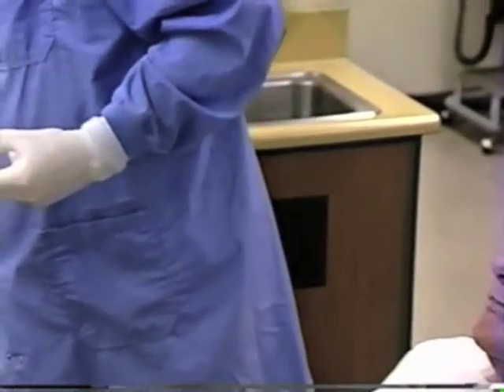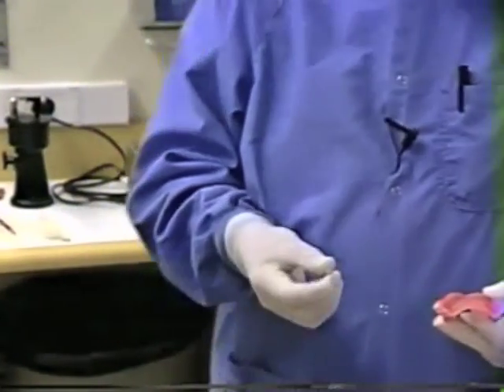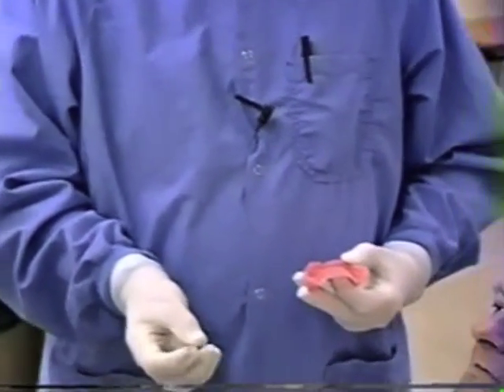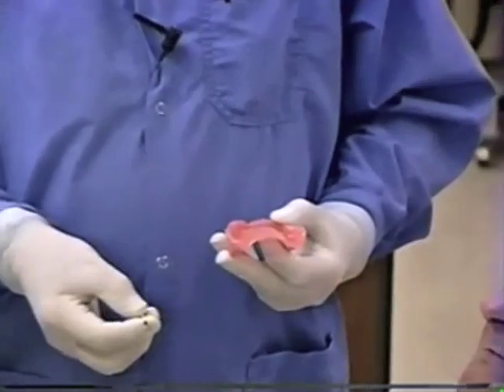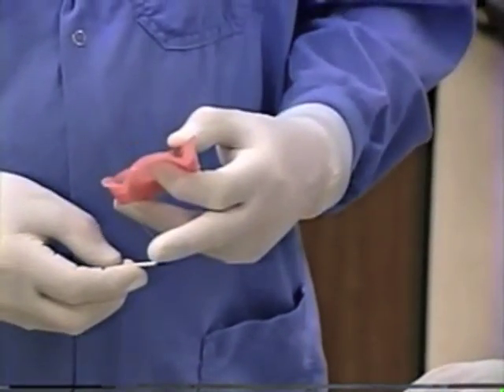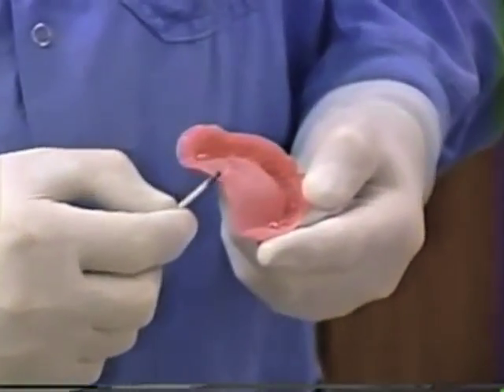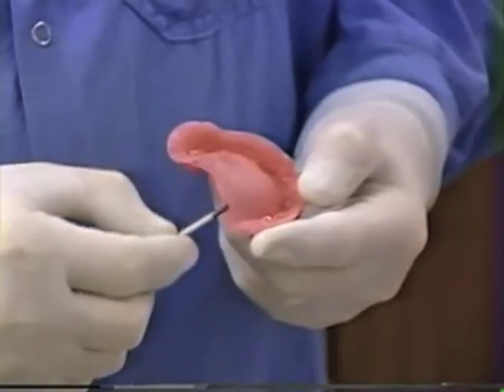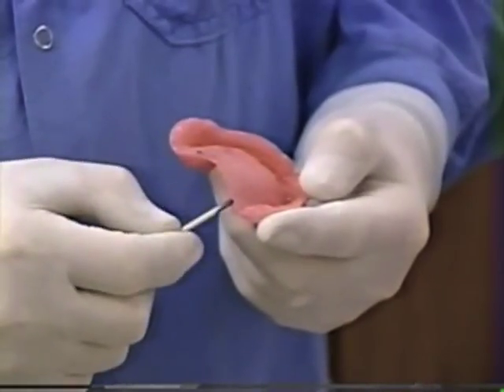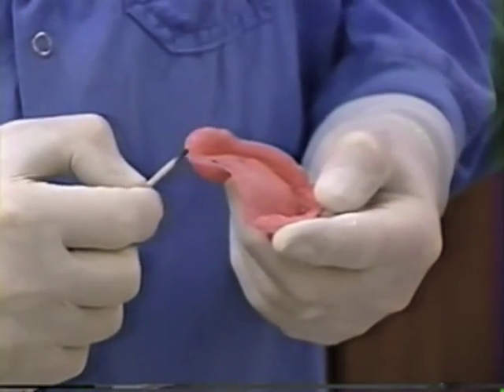Take an indelible ink marker — what we use here at the University of Louisville is a little stick with indelible ink on the end called a Thompson sanitary marker. All that is is indelible ink on the end of a stick. What we're going to do is rub some of that ink right onto the cut edge of the base plate, on the posterior cut edge of the base plate, like so.